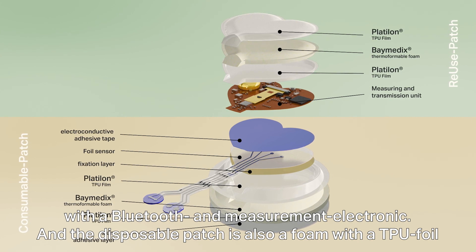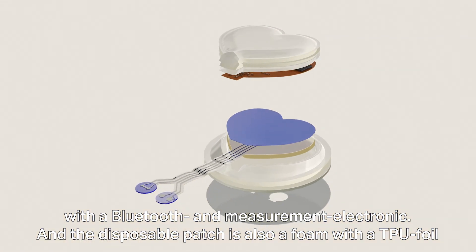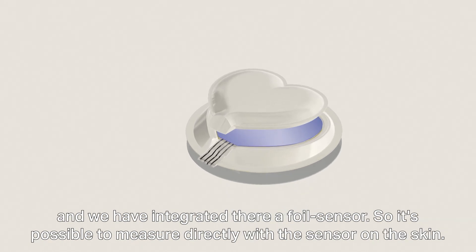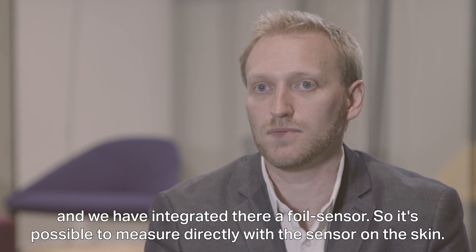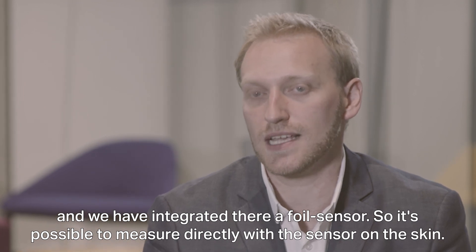The consumable patch is also a foam with a TPU foil, and we have integrated there a foil sensor, so it's possible to measure directly with the sensor on the skin.